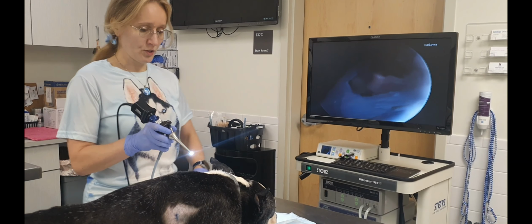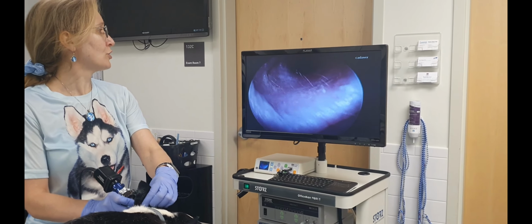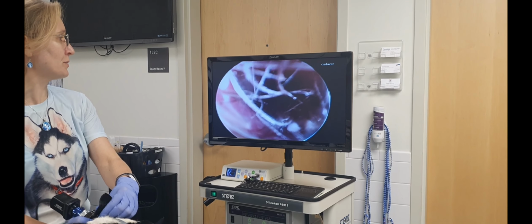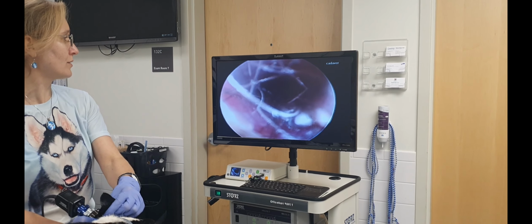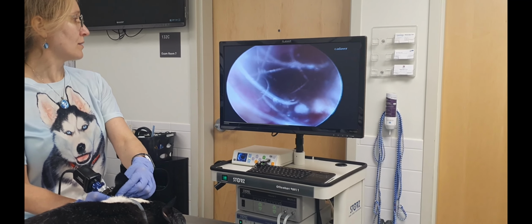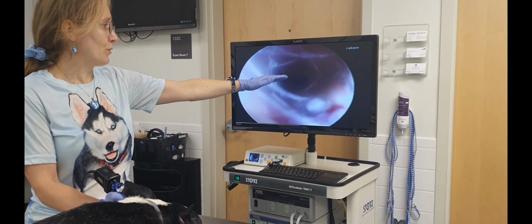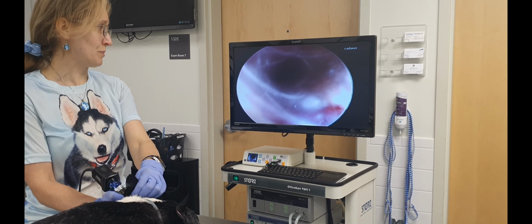In this position, when you go in the ear canal, you will see a normal anatomical positioning of the eardrum, as you are accustomed to see with a normal endoscopy. This cadaver has a little bit of hair, so I cannot see the detail of the eardrum well. But anyway, the upper part will be dorsal, the lower part of the eardrum will be ventral, so you can see exactly how you normally see it in normal endoscopy.